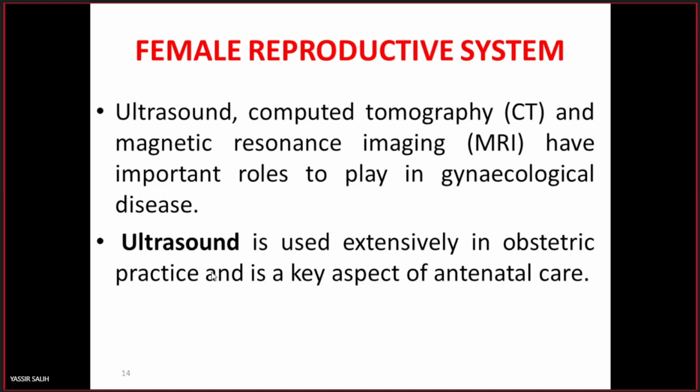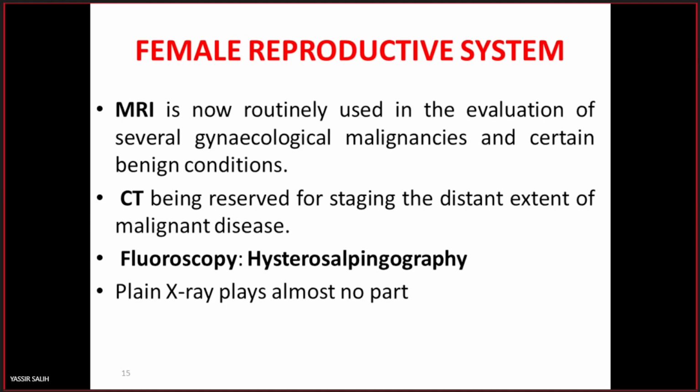For the obstetric case, ultrasound is used extensively. يعني لو حصلوا أي patient عندها pregnant lady followed by ultrasound during the antenatal care. من ما عرفنا أن patient is pregnant, then we follow her by ultrasound مثلا in the first trimester مثلا every week, in the second مثلا trimester every 2 weeks, and so on. But ultrasound is used extensively in assessment and follow up of the patient during the antenatal care.